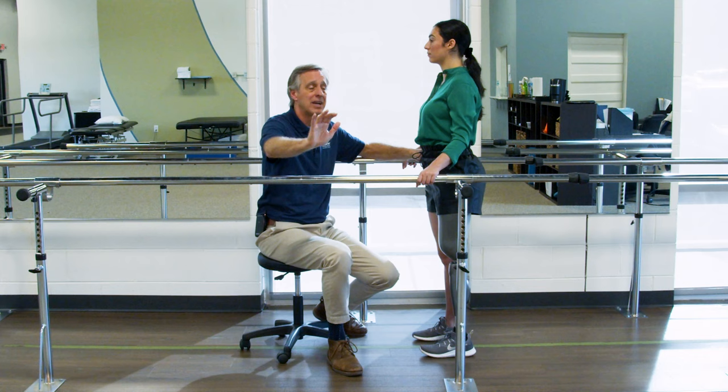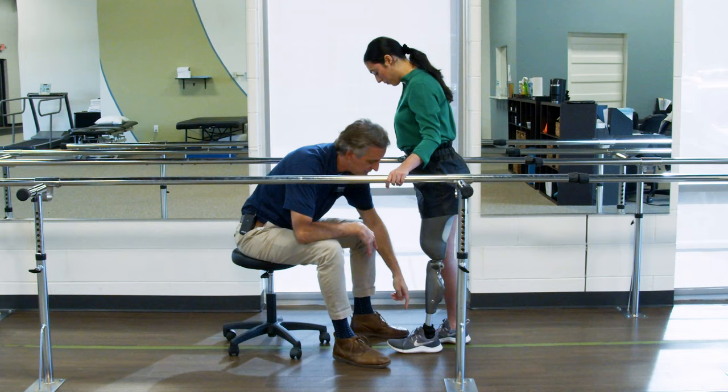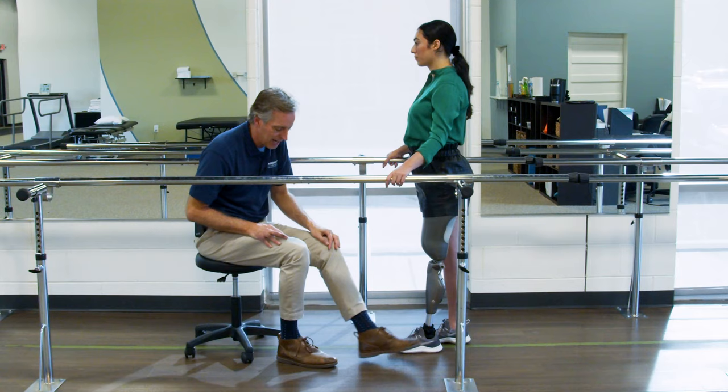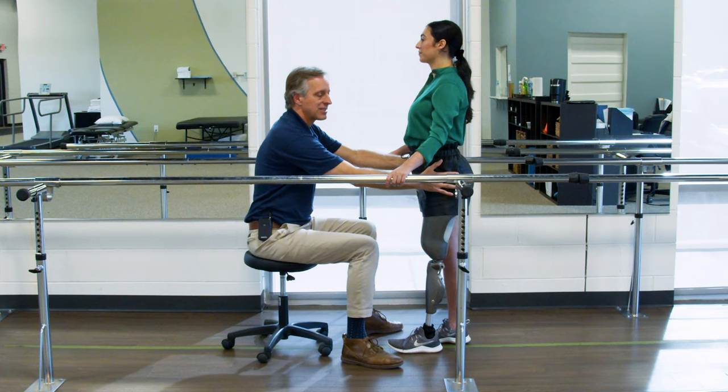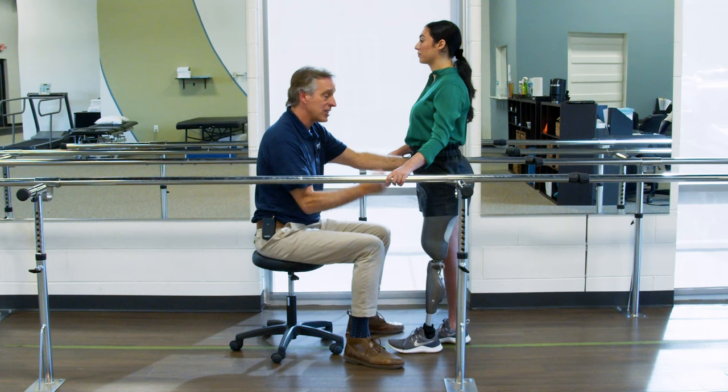So a chop step is this idea that she's going to take a very aggressive step forward, but as she does, she's going to chop that leg down and try to keep the heel inside the length of the toe on the other side. So every step is going to be in this range, not out here. Now the hard part is you're going to see that her leg is going to want to stick and be stiff, and the knee's not going to want to bend. So she's going to have to work pretty aggressively. This is a real exercise that'll wear you out, getting that knee to bend and then chop it down quickly underneath her.